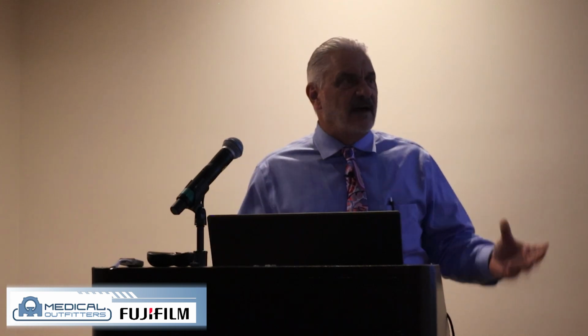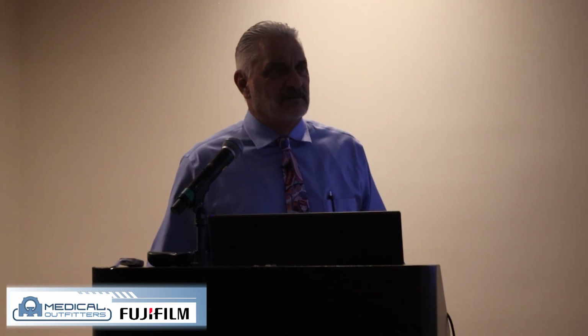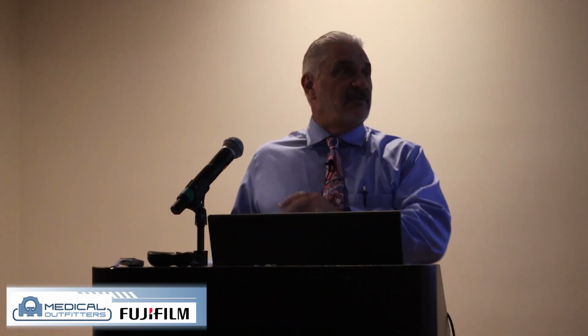How would you manage that? Would you give it a numeric value? Would a radiologist say, that looks like a 37.6% stenosis on that vessel? Said no radiologist ever, right? Every radiologist is going to say, mild, moderate to severe, let's go to the cath lab now.